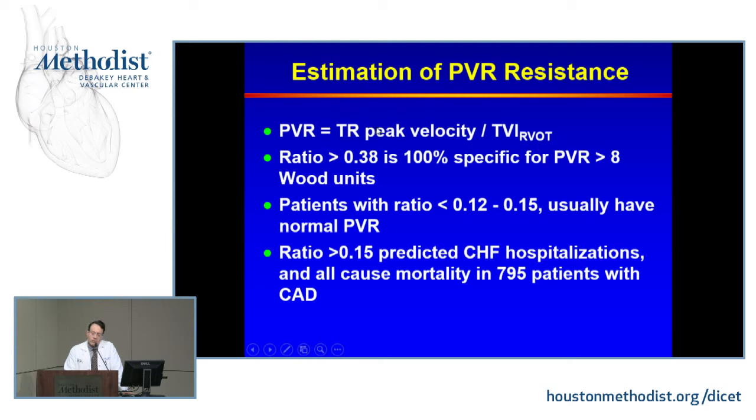First, it is just PA systolic. It is not the mean, and the actual expression to calculate vascular resistance is mean PA pressure minus mean LAP. There is no assessment for what that pressure is, the LAP that is. Flow is not simply RV outflow tract TVI. You need the diameter as well.